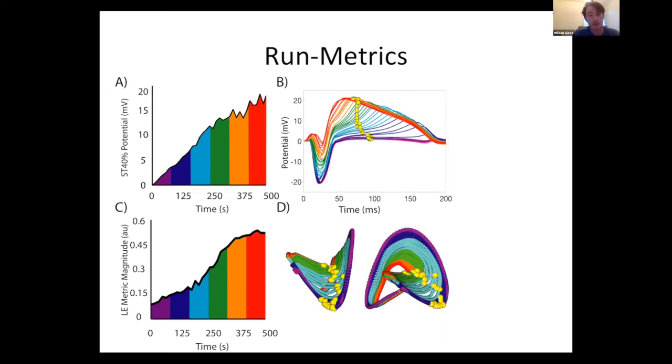And it sort of picks up on nuanced physiological features that don't necessarily exist in the electrogram space or may exist between the electrograms. It's a very complex world, but it's also machine learning, so the explanations for it get pretty fun. But yes, we're distilling an entire episode captured across all electrodes into a single representation. That representation may be more sensitive to ischemia than any of these metrics we're talking about, but we have to determine that first.